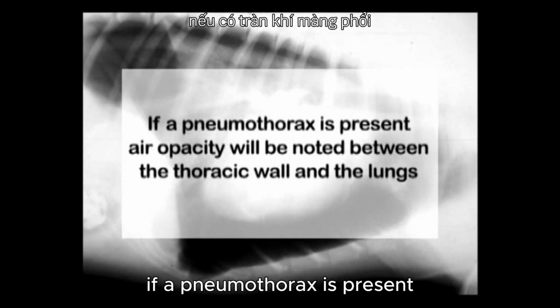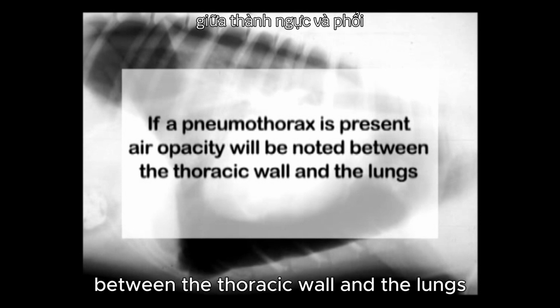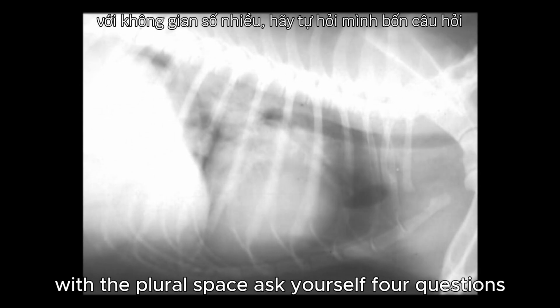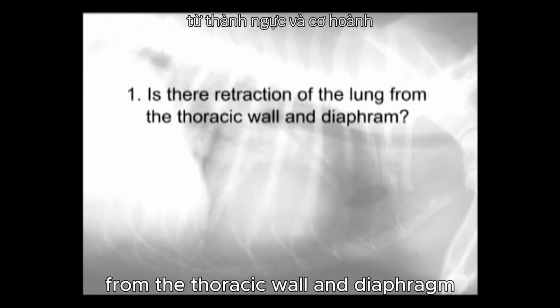If a pneumothorax is present, air opacity will be noted between the thoracic wall and the lungs. In order to simplify this approach with the pleural space, ask yourself 4 questions. Is there retraction of the lung from the thoracic wall and diaphragm?